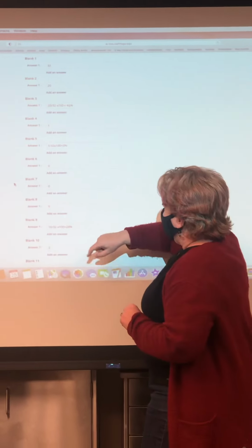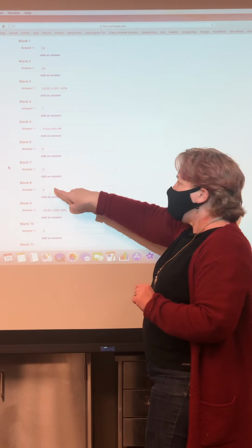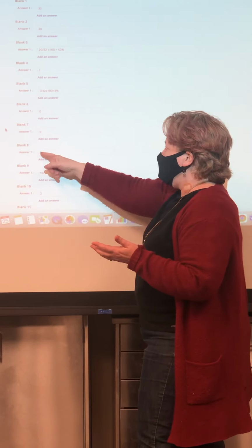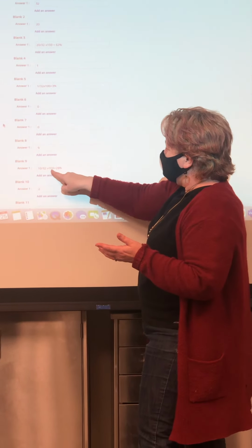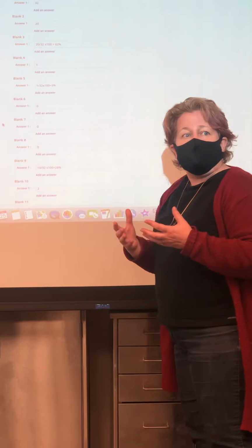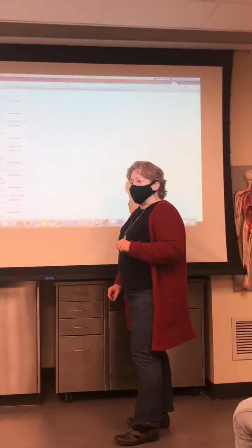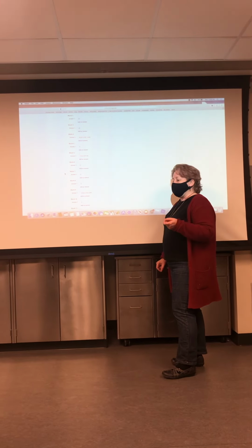The other big one here would be the lymphocyte number. I found 9. Oh, sorry, I have to recalculate this. I think I originally found like 10 and then looked again and it was 9. But anyway, if it was 10 divided by 32, that would be 28%, which again is not an unusual number. It's a little bit high. Could be that you have a little infection going on. That's where you see an elevated lymphocyte number. When you're really fighting off something tough to fight off, then you would get more lymphocytes.